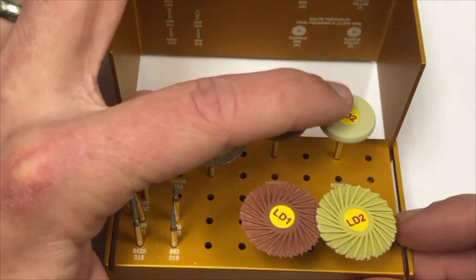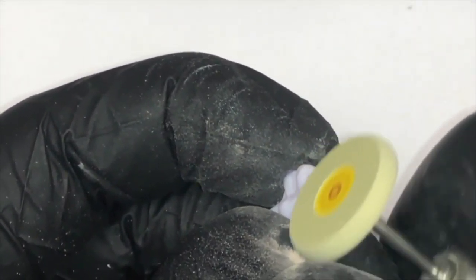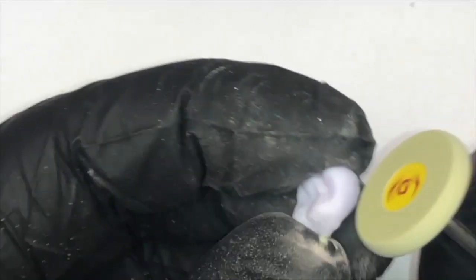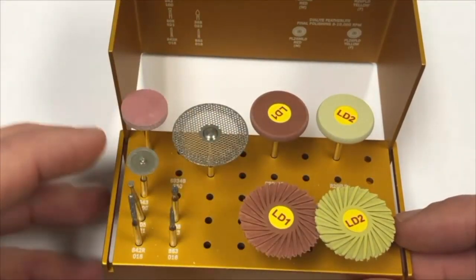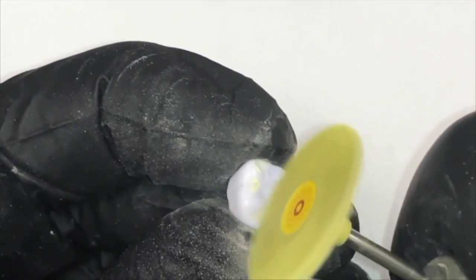Next, the LD2 fine Dialite Wheel is used in similar areas as the medium Dialite Wheel — the axial surfaces, contact points, and higher areas of the occlusal surface — for final axial polishing and occlusal high spots at 8,000 to 10,000 RPMs. Remember, it is recommended to back off speeds when moving to the fine polishers for optimal aesthetic surfaces. The final polish of the occlusal surface is performed with the LD2 fine Dialite Featherlight Polisher, which adapts to the deeper areas of the occlusal surfaces. Once this step is complete, the restoration is ready for the ceramic furnace for final crystallization or staining and glazing.